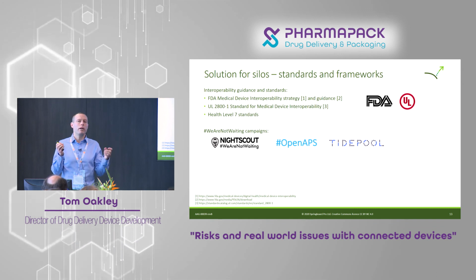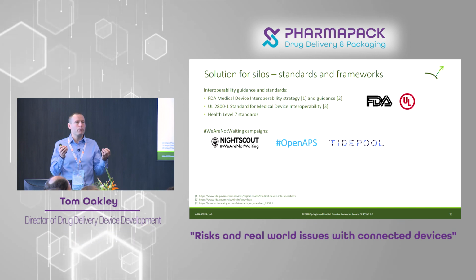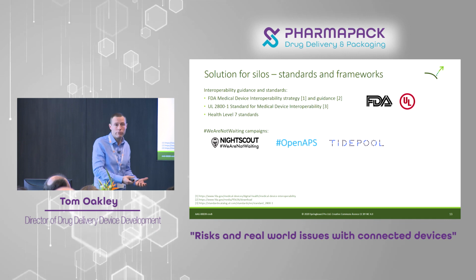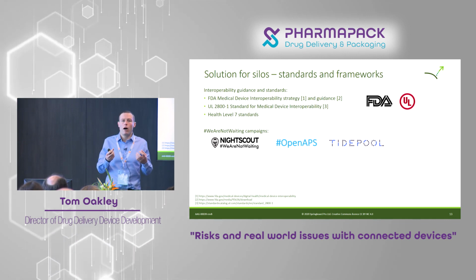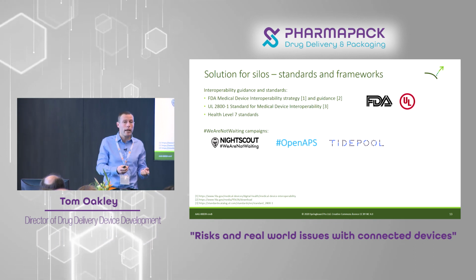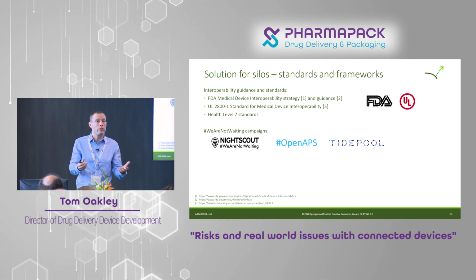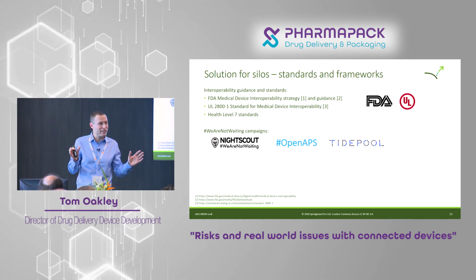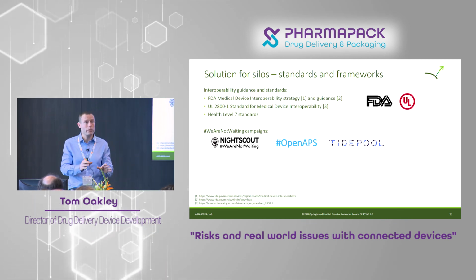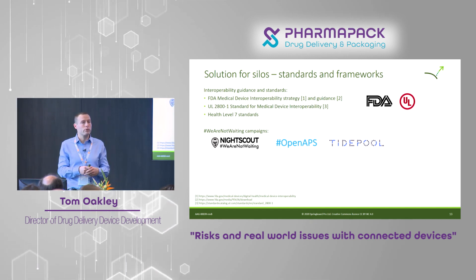So these are people, and this is an example from the diabetes field again. This is where people who either live with diabetes or have family members, so they might be the parents of a child with diabetes, are hacking their glucose meters and their pumps to make them work together. There's a website called Night Scout where people are showing you how to do this. They say, at your own risk, you can do this, but we're not waiting for interoperability. We want it now. There's also a set of protocols and software called OpenAPS.